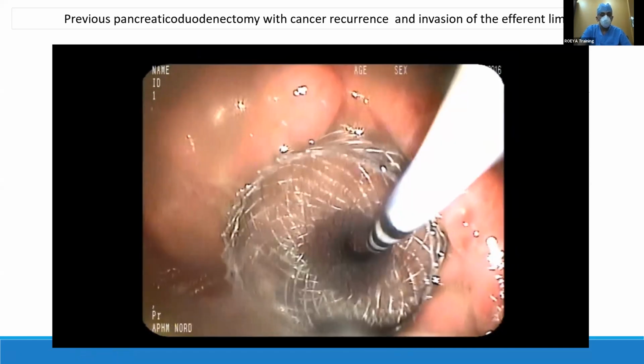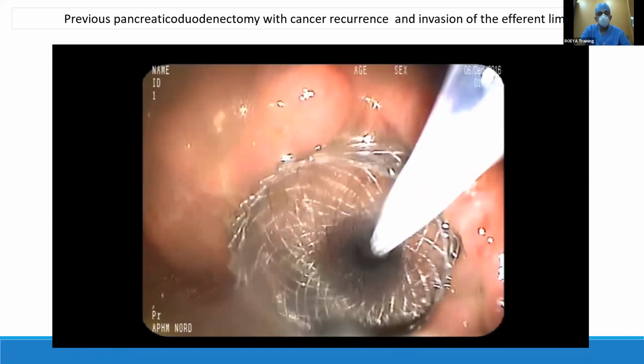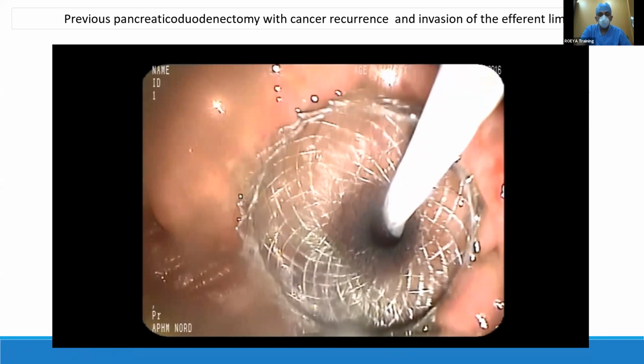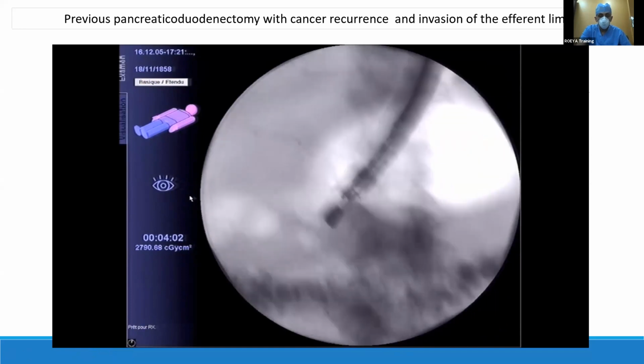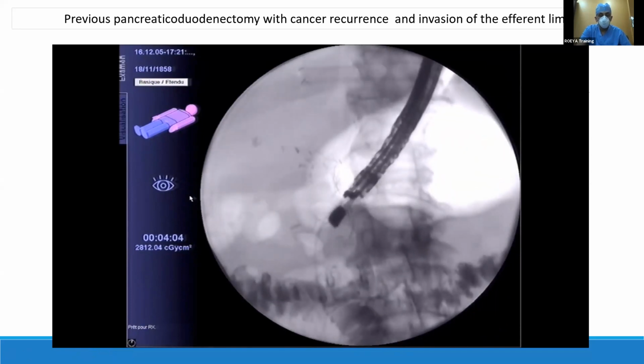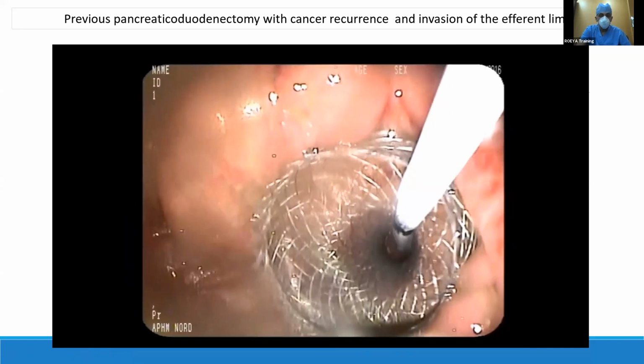Again, this is a video from my friend Marc Barthet. So again, it's not a daily practice. However, this is one of the future things happening now all over Europe to treat gastric outlet obstruction rather than duodenal stenting.